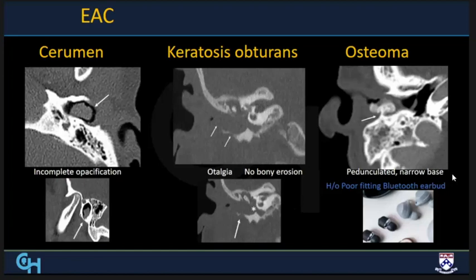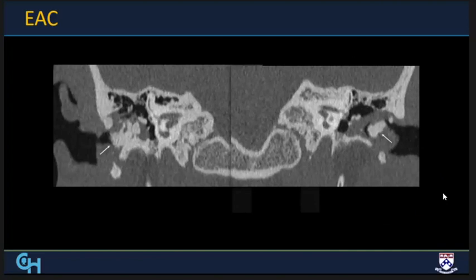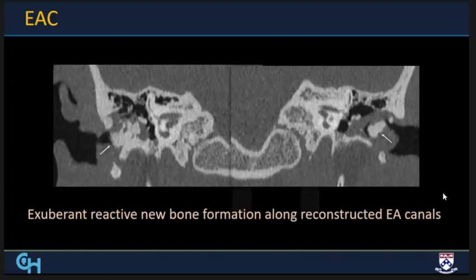Bony lesions in the external canal with a pedunculated narrow base are osteomas — interestingly, one patient presented because of a poor-fitting Bluetooth earbud. Compare that to a case with exuberant broad-based bony outgrowths into the canal, which might look like surfer's ear, but was actually a patient who had undergone bony reconstruction of the external auditory canals for stenosis bilaterally, with reactive new bone formation and cerumen accumulation around the bony outgrowths.